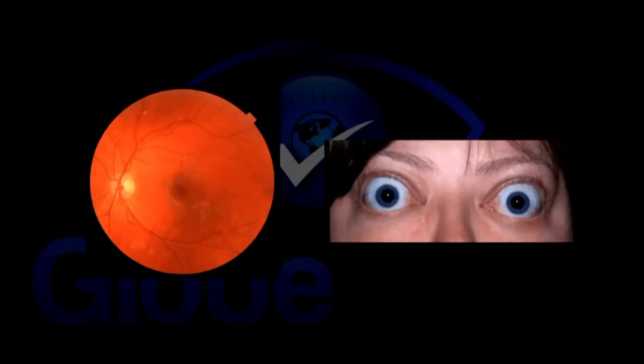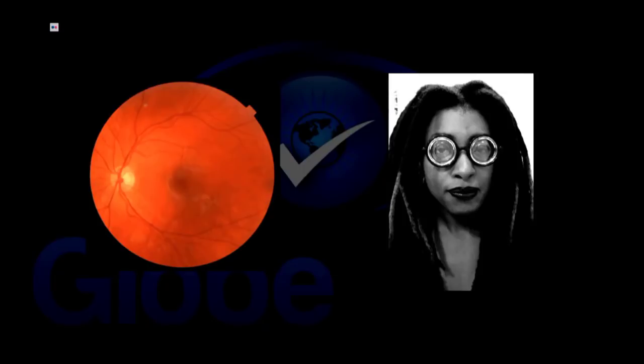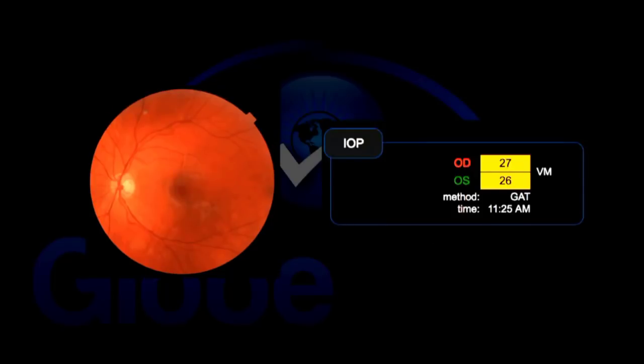As we move on, again, a common theme here: we're missing a lot of things. This patient has obvious thyroid ophthalmopathy and needs a referral to a medical doctor. We're also not picking up refractive errors. This patient is an obvious high myope, but we're not picking up presbyopia. We're not picking up hyperopia. So patients who are just in need of eyeglasses are walking around with uncorrected vision, and they are many. We're not picking any of that up with fundus photography as well.